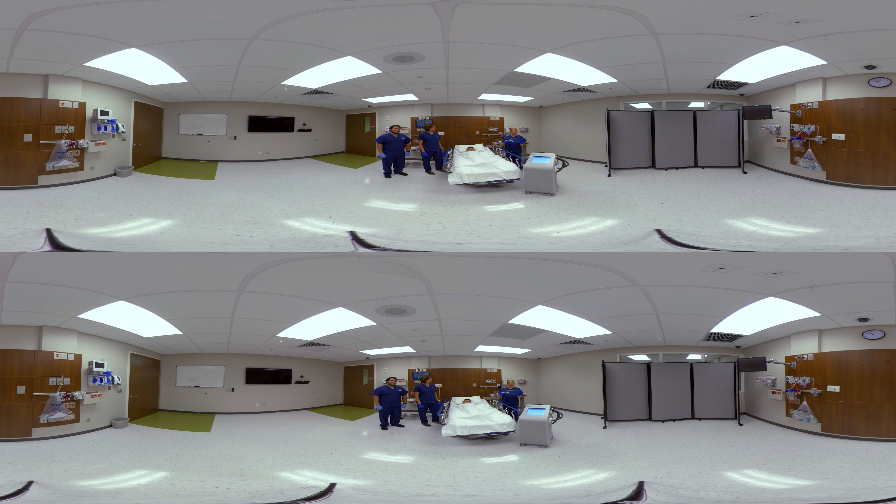When you take it out of the package, it looks like this. On the other side of it, we have a cloth liner. You can choose to use the pad with the cloth liner in place in order to protect the skin. When doing so, you can secure the pad to the patient's body using the Velcro straps provided like this.